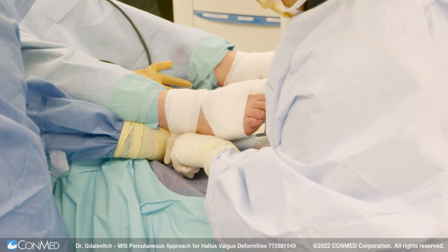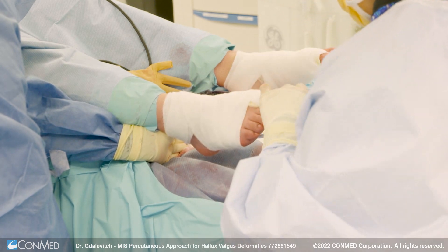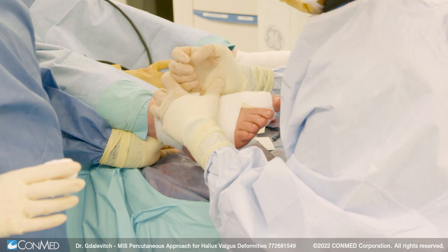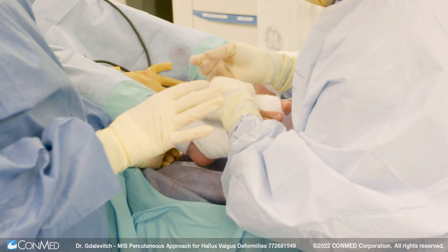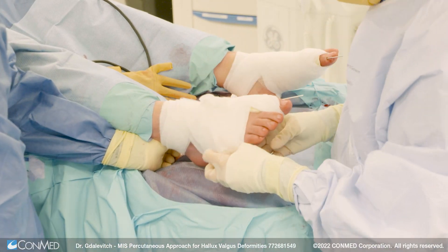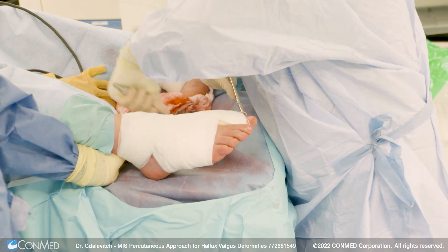At three and a half weeks the wire is removed. This is a painless process, after which point the patients can go into a regular shoe. They're allowed to walk as much as they want for the first three months after surgery. After radiograph at three months, if there's good bony healing, they're allowed to return to impact sports and activities. The wire is cut at the level of the skin and bent so that they can't catch it on anything.